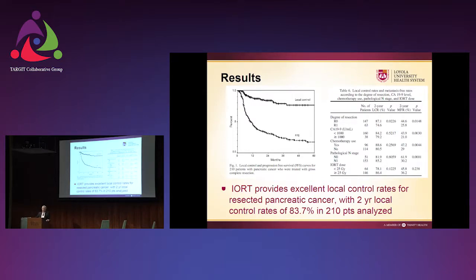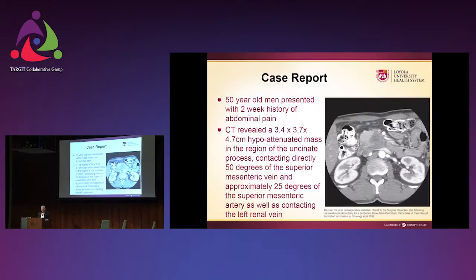We just stopped doing it because it was difficult. This is a case report that Dr. Holford did the surgery on, and we collaborated on the case report. It got published, I think, in Frontiers this week. We just talked about the role of intraoperative radiation, or Intrabeam, in pancreatic cancer.